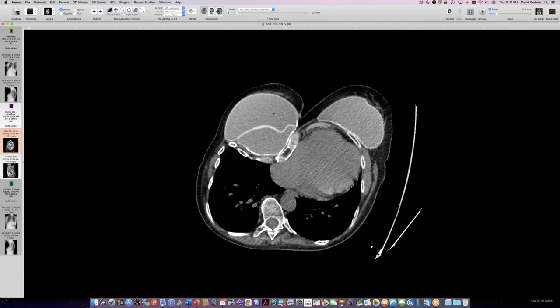And then she's had implants placed, partly to fill this pectus divot in her anterior chest. So a bigger implant on the right than the left. And it's all of this opacity from this implant that is causing the whiteness that looks like pneumonia at first glance. So pectus pseudopneumonia, rather dramatic case. In this case, part of the extra whiteness is this implant here, which is designed to help cosmetically cover the pectus defect.